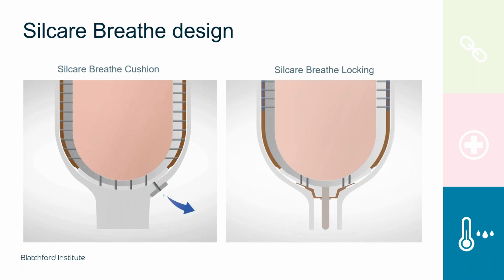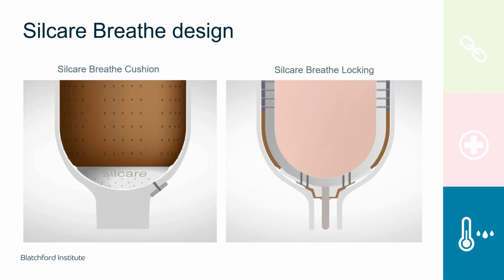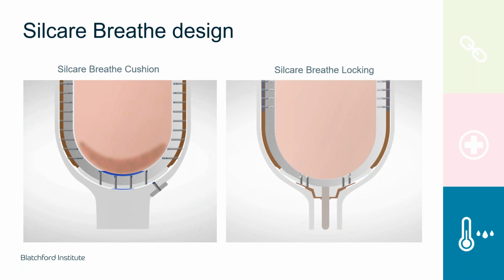And this was easier to design in the cushion liner because the addition of a suspension sleeve means that air doesn't get back into the system. Whereas in a pin suspension, if that's the suspension method of choice, we don't have a suspension sleeve, and therefore it was harder to create this one-way valve effectively. So the valve was added distally.